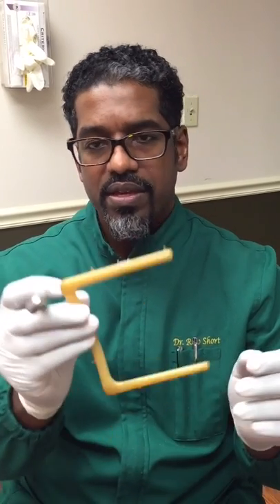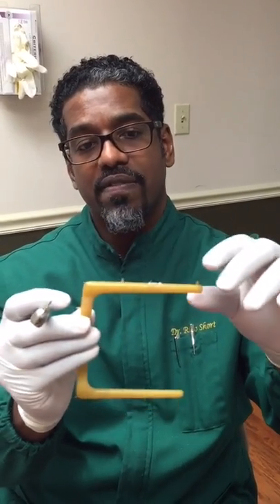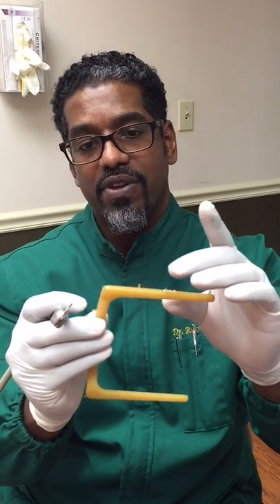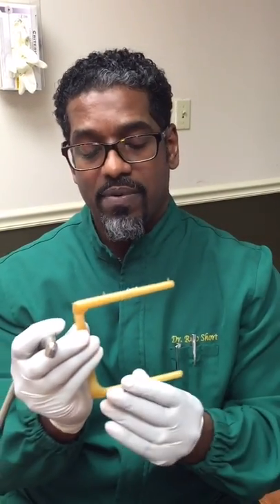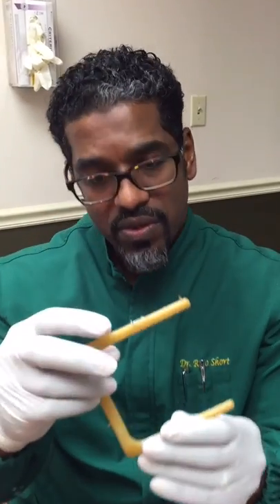And voila, it's fixed. On the side it's not as critical because you still have a prong there, but if a prong breaks off on the corners, it is important to have some type of stability or your rubber dam is going to flop around. So the rubber dam frame is fixed — you don't have to throw these away when they break.